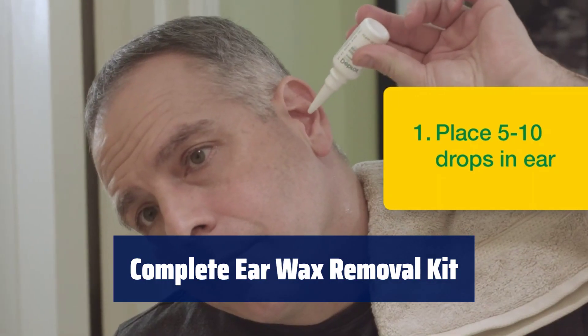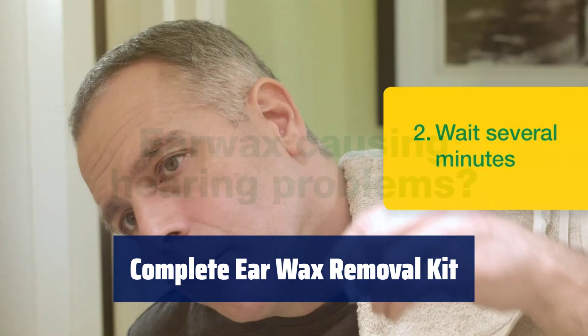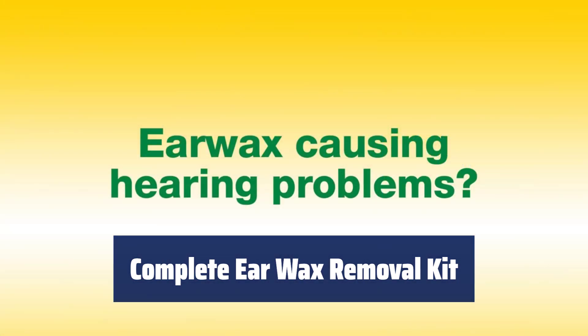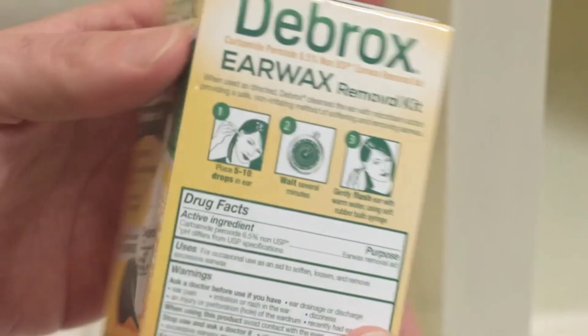Contains one bottle of Debrux Earwax Removal Drops, 0.5 FL oz, and a soft rubber bulb syringe. Squeeze 5 to 10 ear drops in each ear and flush with water using the bulb syringe.